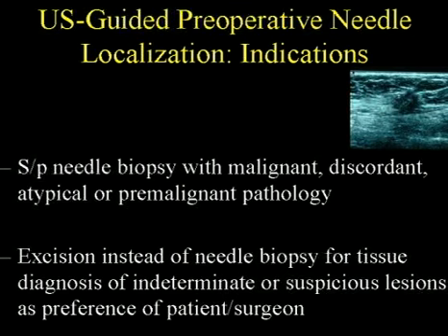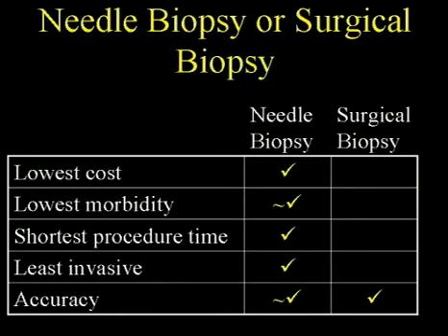Also, localization of lesions for surgical excision can be done for lesions for initial histologic diagnosis, as per the preference of the patient or the surgeon. In the past, for histologic diagnosis of a breast lesion, the only option was surgical biopsy. But over the last 15 years, needle biopsy has largely replaced surgical biopsy.